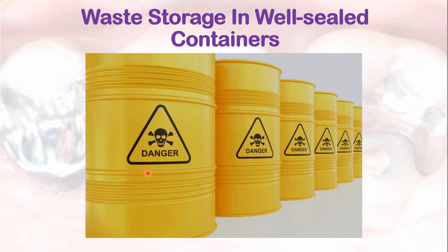Excess mercury capsules and other mercury-related waste should be collected and stored in well-sealed small containers. This waste, along with other dental waste, should be handed over to and properly disposed of through a reputable waste management company.